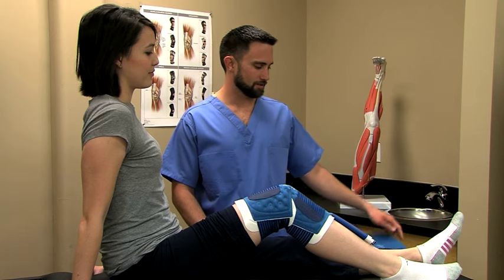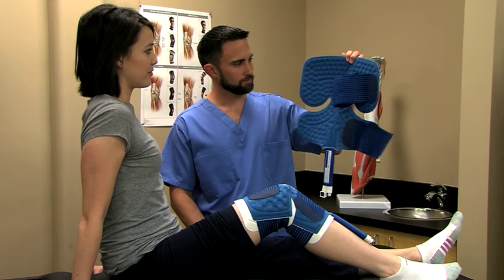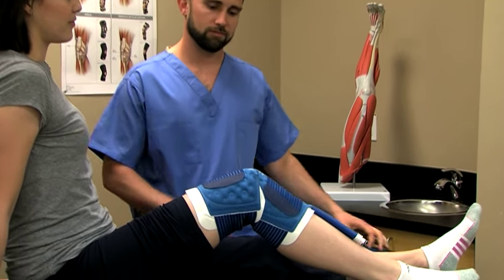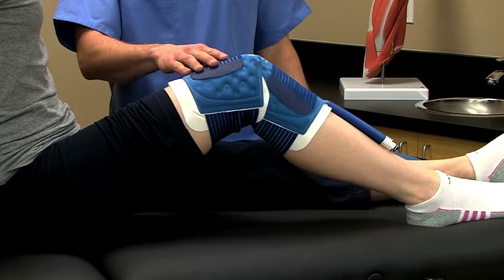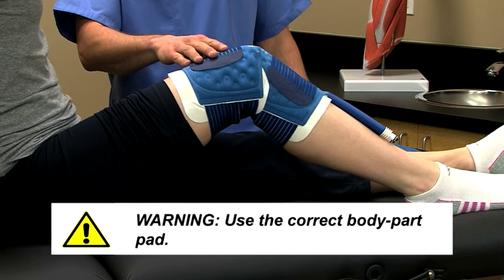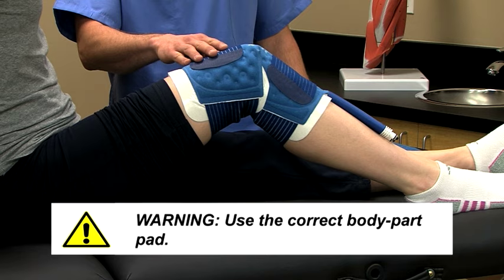PolarCare units come with body part-specific pads. This is a multi-use pad, which can be used on various core body parts, while this one is for the knee. For patient safety, it is essential to use the pad designed specifically for the body part being treated.